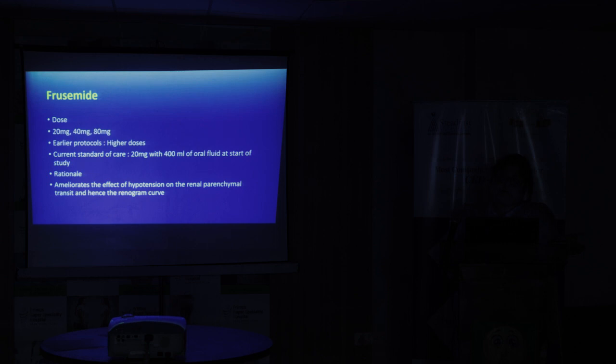But it was found that the hypotension which the high dose of Lasix created interfered with the renal parenchymal transit and the renogram curve, and we started underestimating the renal function. So the protocol normally today is to give about 20 milligram of Lasix along with a 400 ml fluid bolus, either intravenously or orally, at the start of the study.